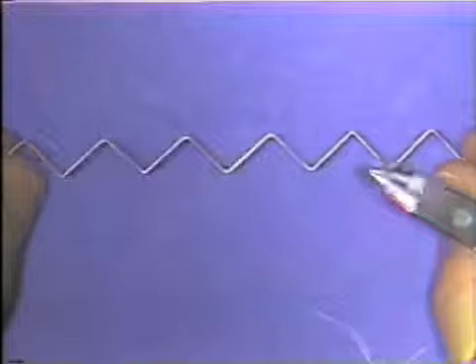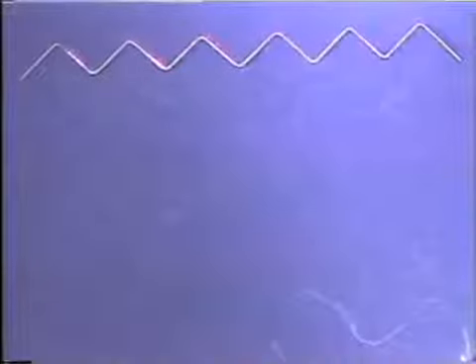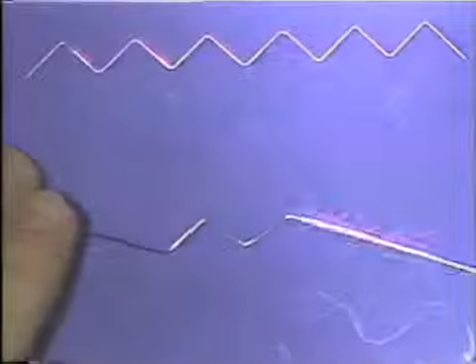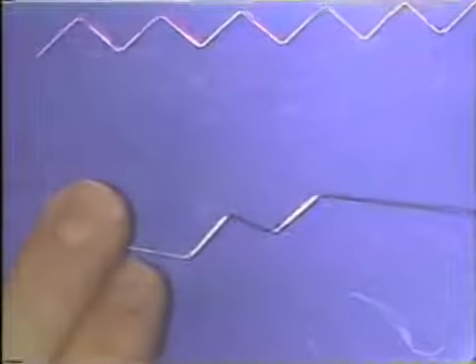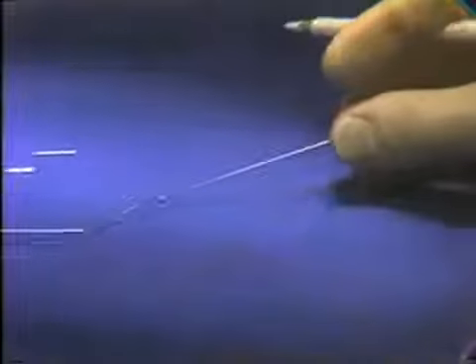It is possible to correct the plane in space of a wire. However, the best example of this procedure is to flatten a wire that is bent out of shape. To flatten a wire, what you're actually doing is adapting it to the flat surface. You start by finding a stable starting point.